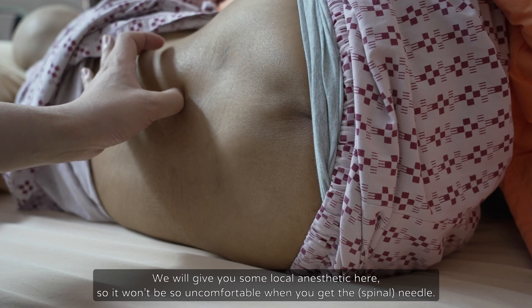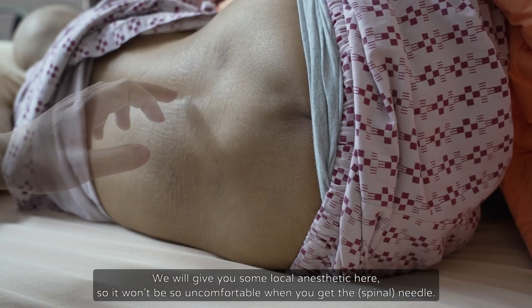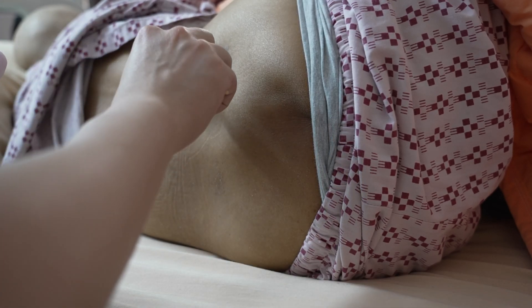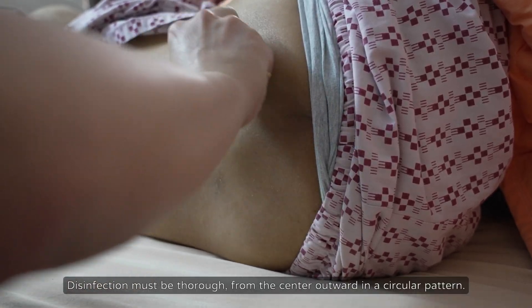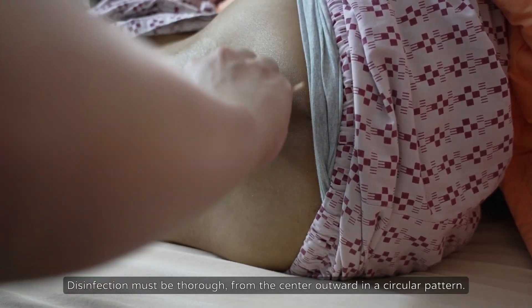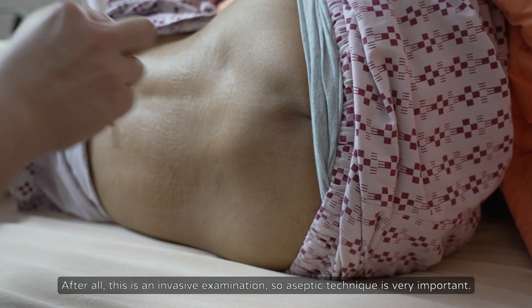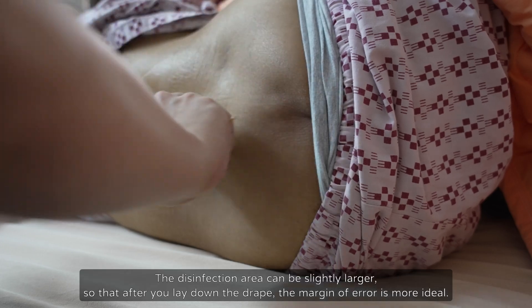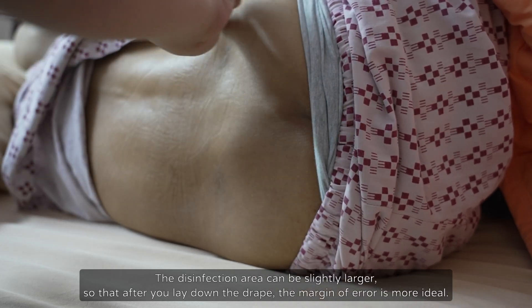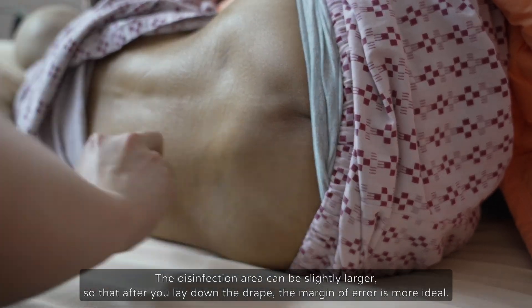We will give you some local anesthetic here, so it won't be so uncomfortable when you get the needle. Disinfection must be thorough, from the center outward in a circular pattern. After all, this is an invasive examination, so aseptic technique is very important. The disinfection area can be slightly larger, so that after you lay down the drape, the margin of error is more ideal.